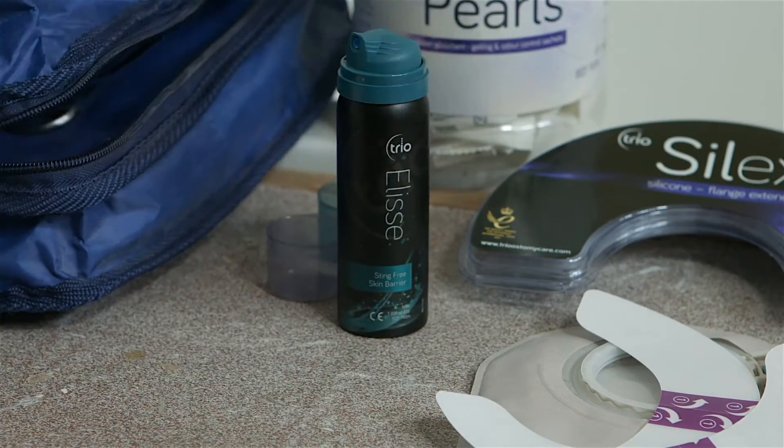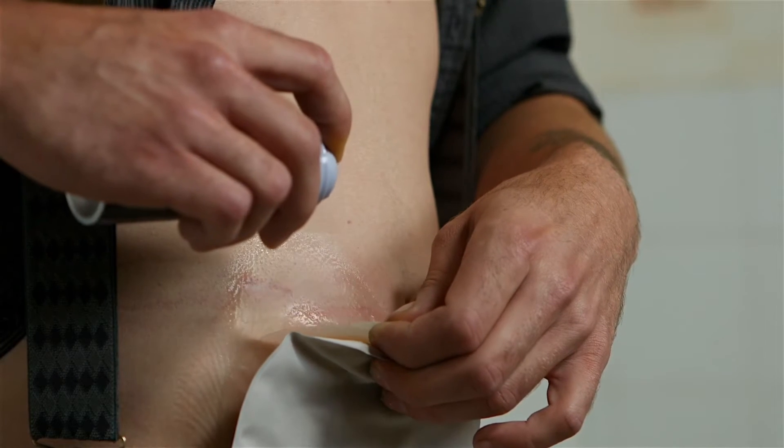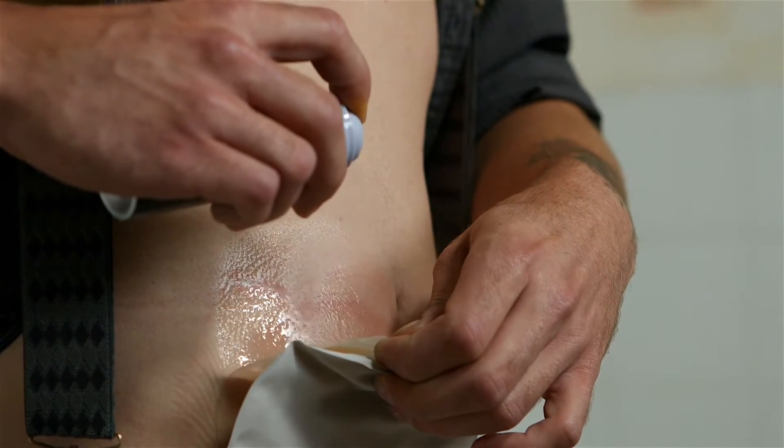One little spray across the top of the flange is enough for the whole thing to peel off. It sneaks in under the flange and I don't know how it does it, but you just don't feel a thing. It's really, really soft.